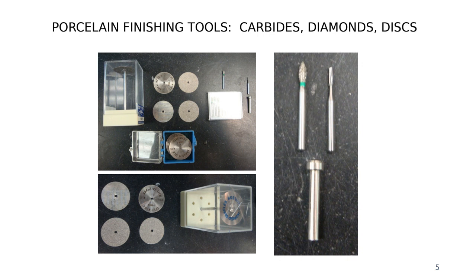So you see multiple, it's the same shape, the same diamond burr, but if you look at it and feel it, one is coarse, one is finer. It's the same for the carbide burrs. You're going to see that some carbide burrs are also color coordinated.